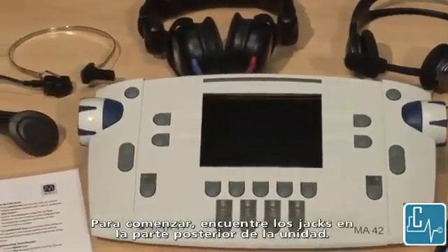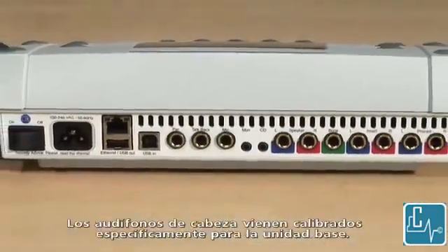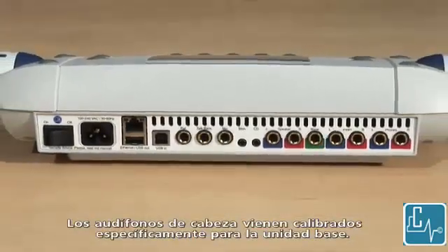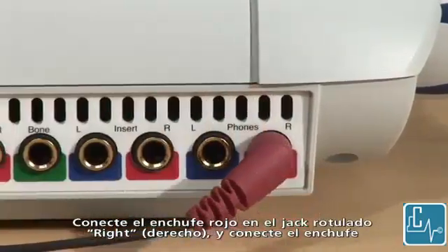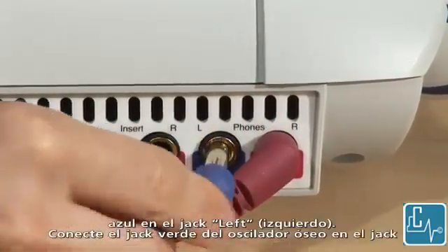To get started, locate the jacks on the back of the unit. The headphones come specifically calibrated to the base unit. Insert the red plug into the jack labeled right and insert the blue plug into the left jack.